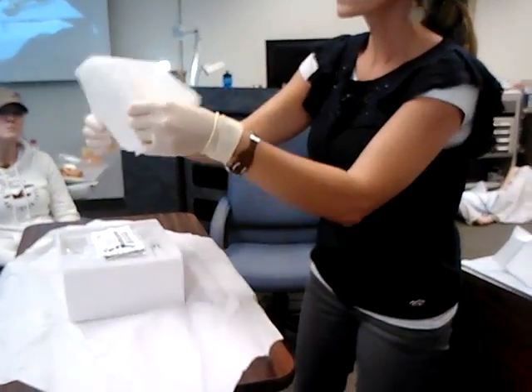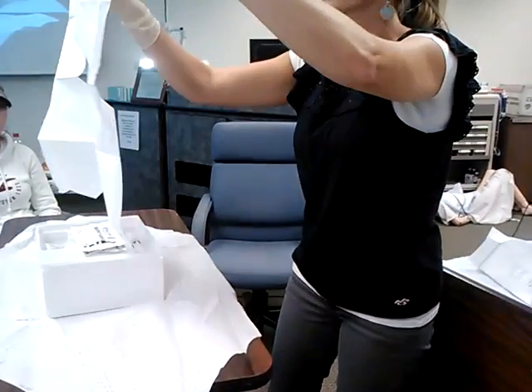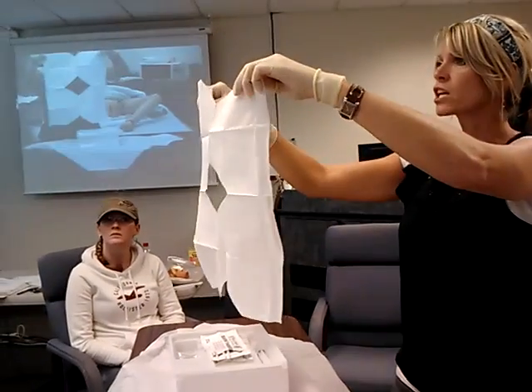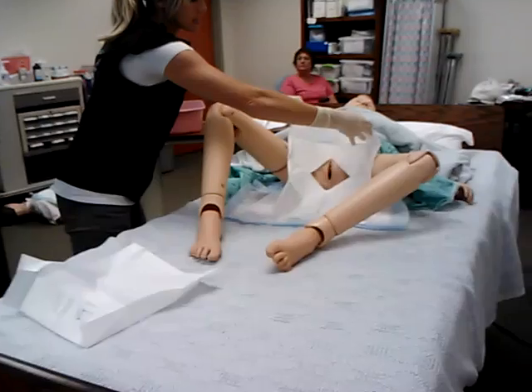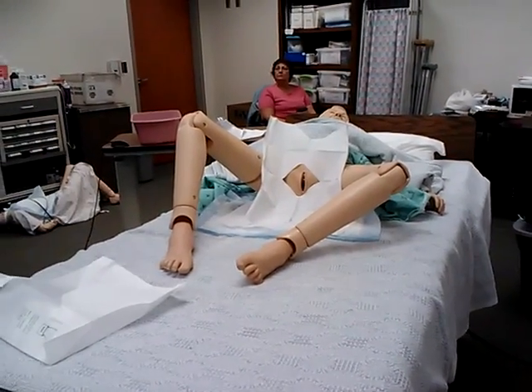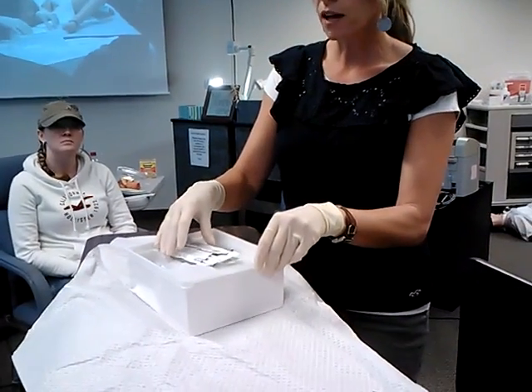Your next thing you guys have in here is another sterile drape, your second sterile drape. This one looks like this. So that diamond piece is going to go right over the perineum, like this. Making sure you're not touching your patient. Okay. Then you've got the 3 swab sticks.